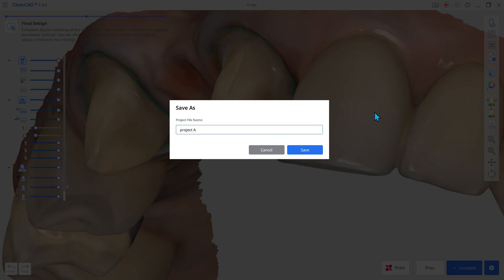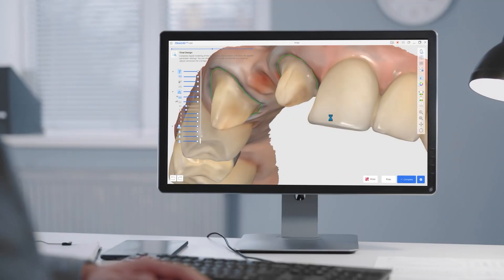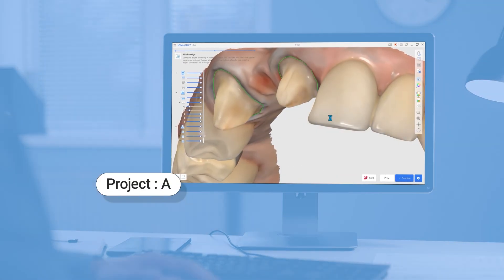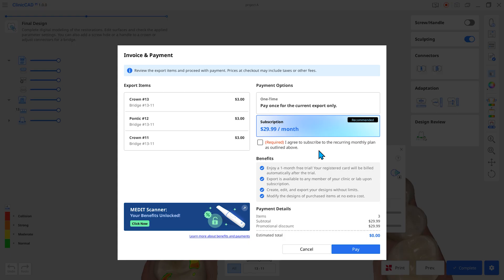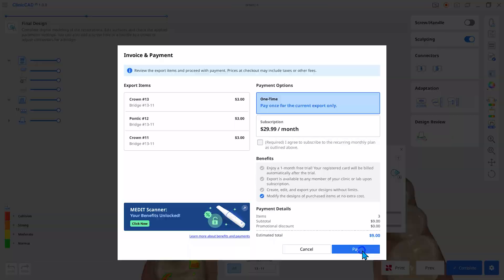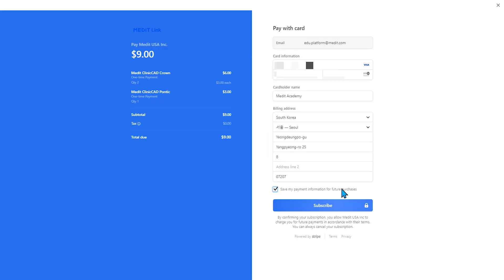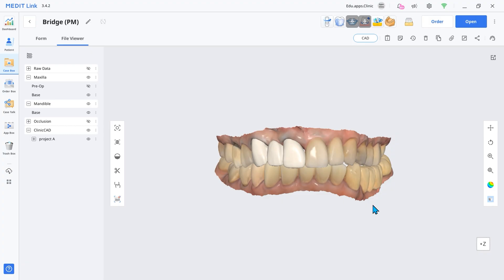A project refers to the workspace you just designed. Once saved, proceed with payment to extract the design file. After payment, the app closes and the file is extracted.